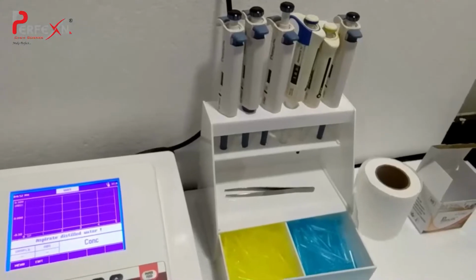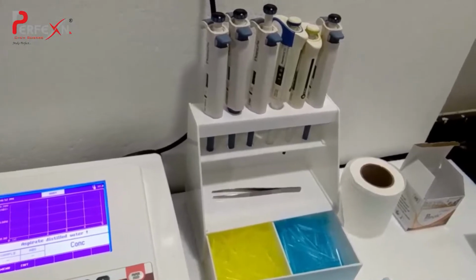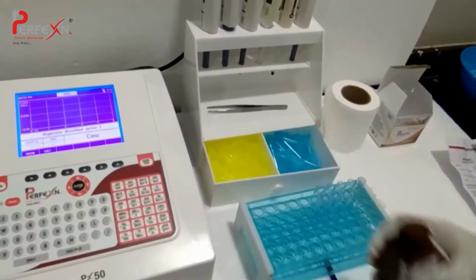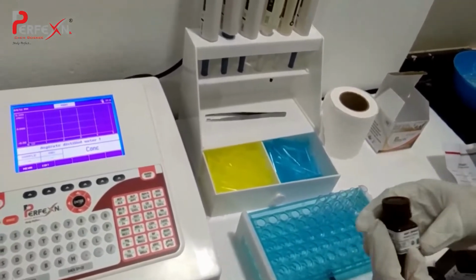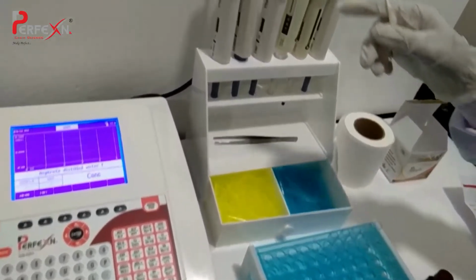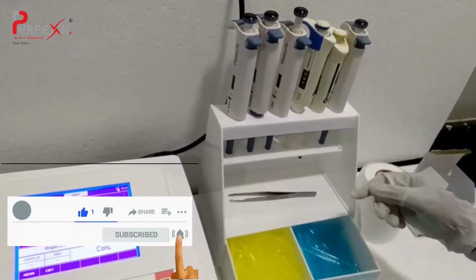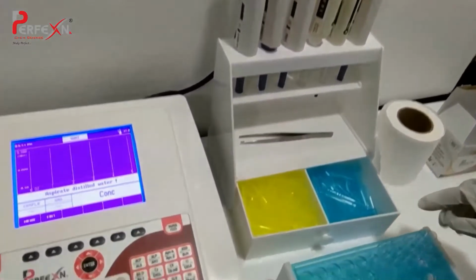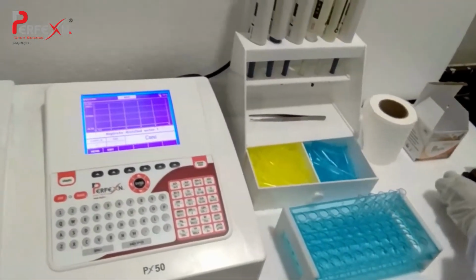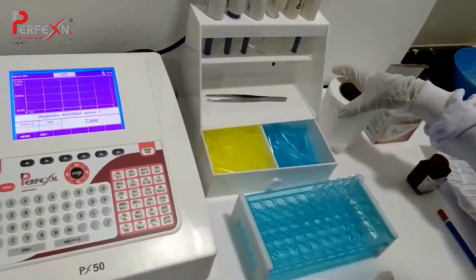For carrying out the procedure for SGOT, I will tell its requirements. We want the SGOT kit with the reagents R1, that is the buffer reagent, and R2, that is the substrate reagent. We need variable pipettes of 1000 microliter and 100 microliter with dry and clean tips, clean and dry test tubes, the serum sample, and tissue paper also.